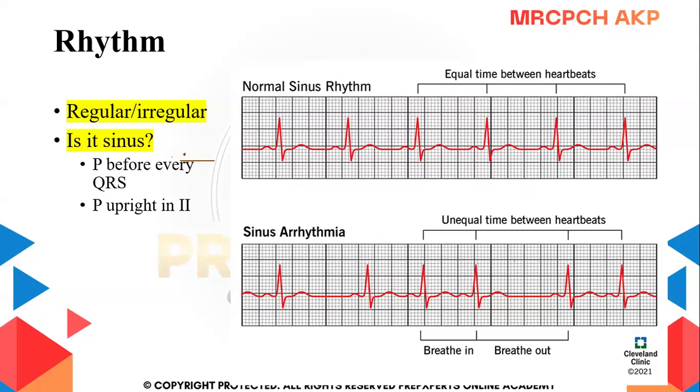Okay. So what is a regular ECG and what is an irregular ECG? Does any of you know about it?